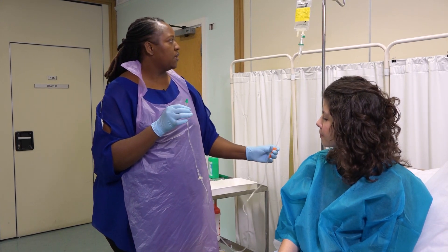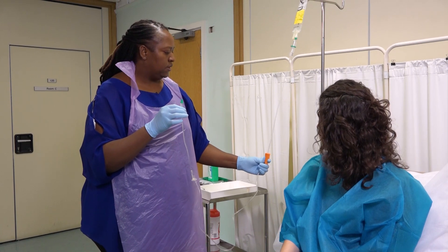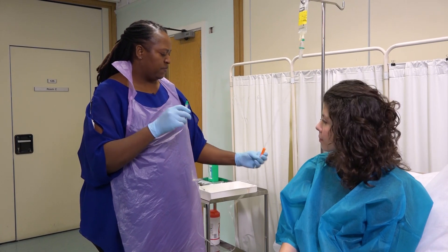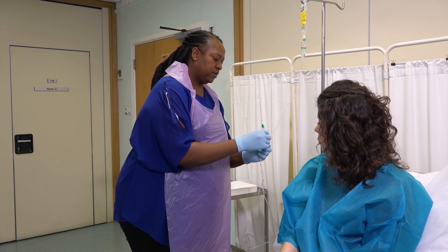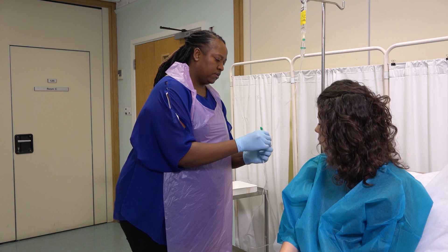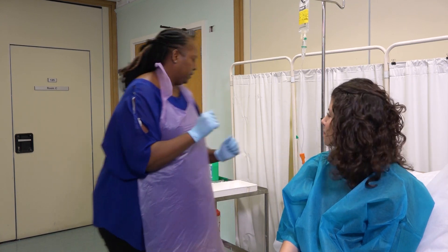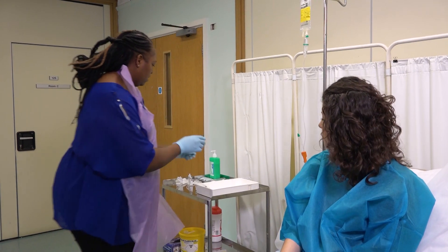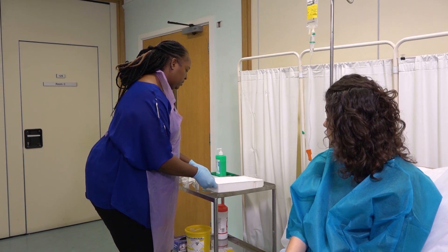Close the clamp. Bring your tray containing an alcohol wipe and saline flush closer to your patient.